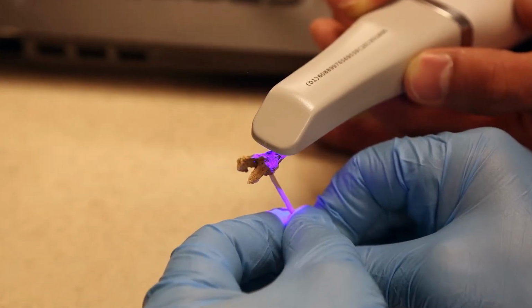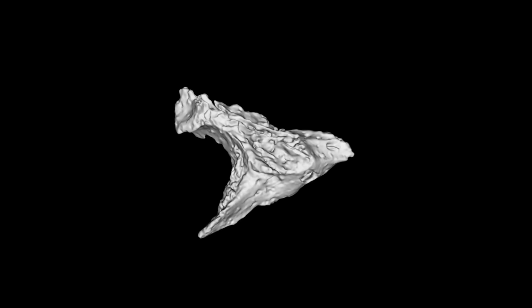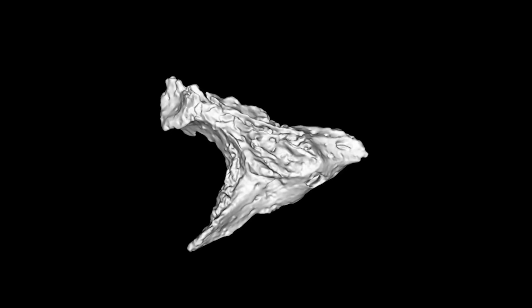This has been a project of enormous interest to me and has involved a team of about 30 scientists. In fact, Carestream Dental has been very generous and loaned imaging equipment for use at Jamestown for some groundbreaking new imaging documentation. The CS3600 intraoral scanner was used to image individual bone fragments to help reconstruct the cranial base. We're very interested in putting these STL files together via an algorithm so that we can better understand the shape of the cranial base, which was in 64 pieces of bone, actually. Wow, yeah. That's amazing.